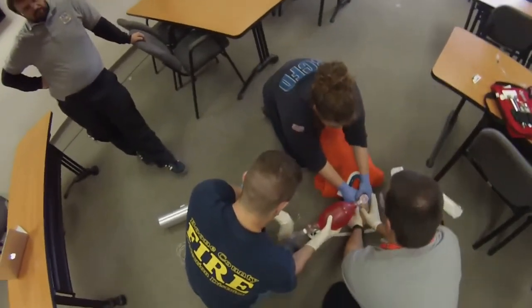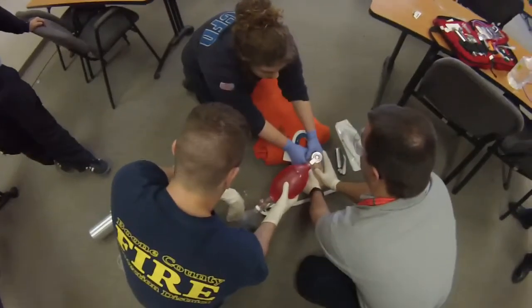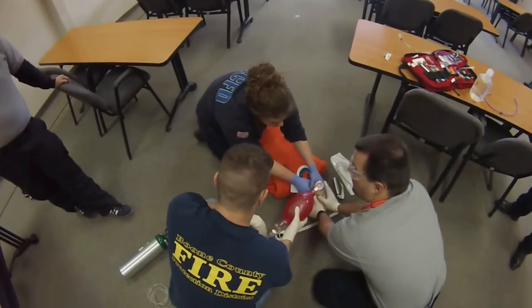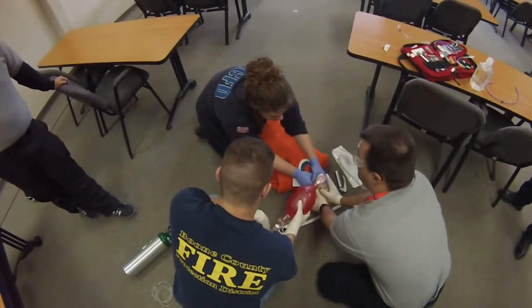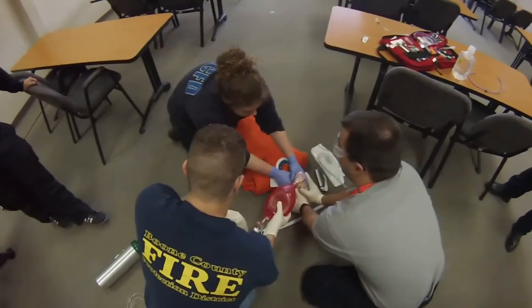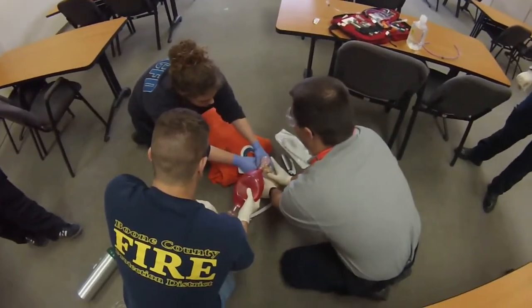At that point, we're going to keep the mask seal on everything still. We're going to do two more full breaths, and then I'm going to attempt to intubate. You're going to pull the mask and you're going to keep c-spine. Alright? Ready? Here we go.